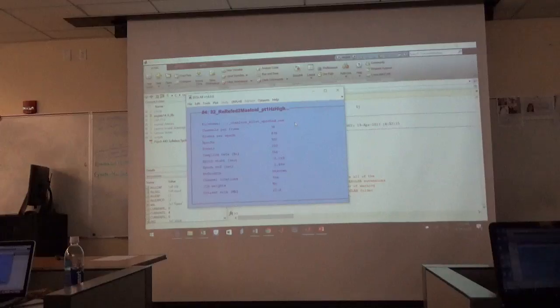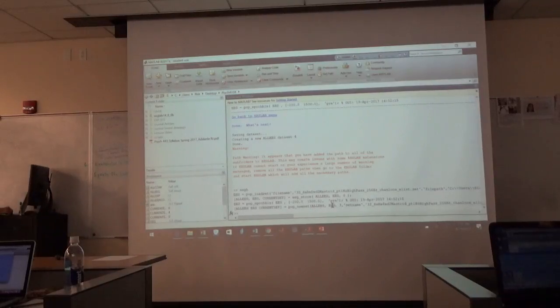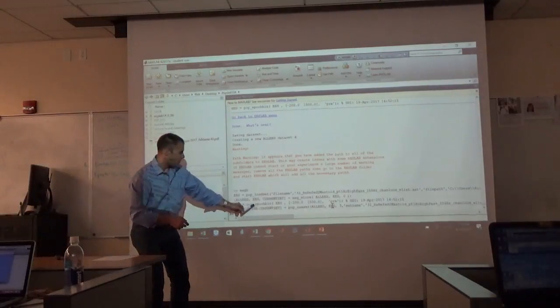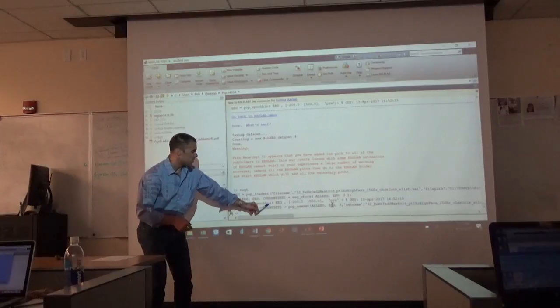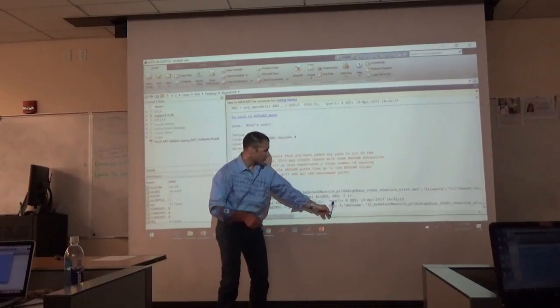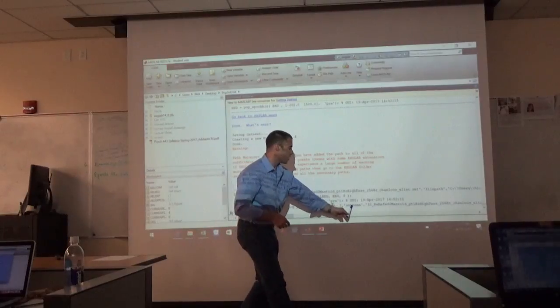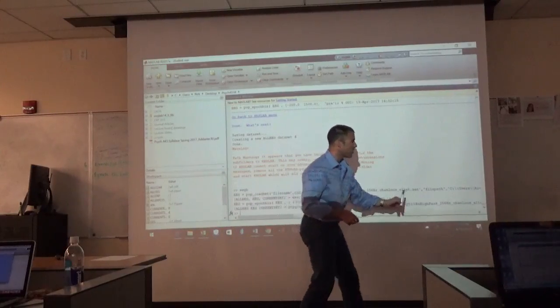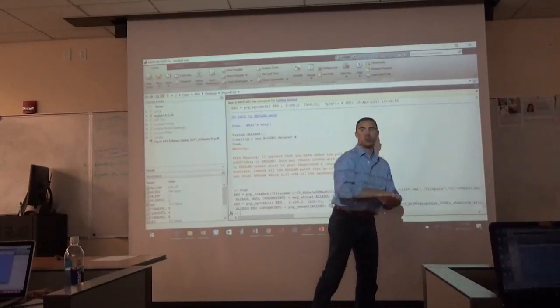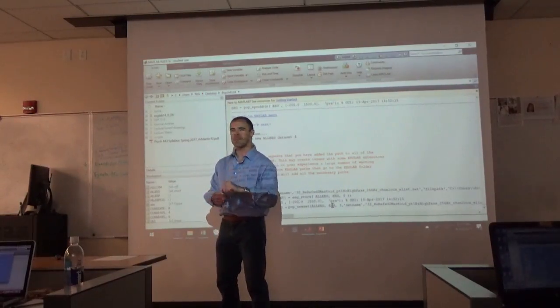Now, just for fun, I'll show you again. If we do EEG H in our command line, see how it shows us epoch or into bins. There's our parameters, -200 to 1500 for the pre-stimulus period, and then we just saved it as a new data set with our data set name. Going all the way out here, if you scroll it out, you'll see our pathway too. So it does remember what we did.